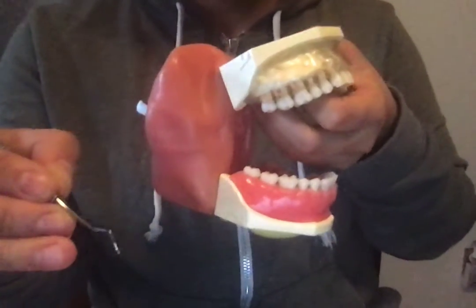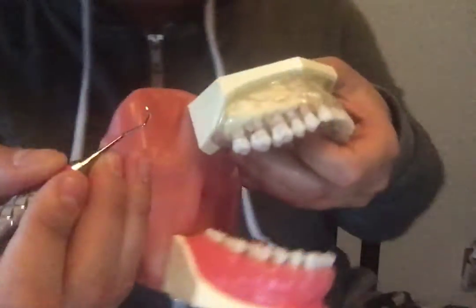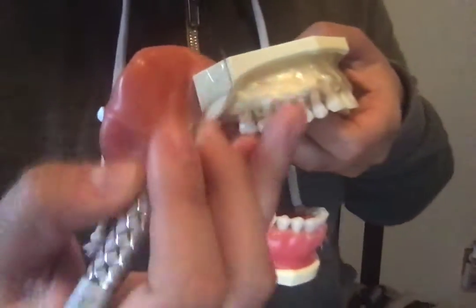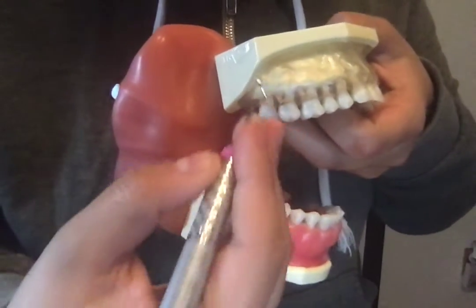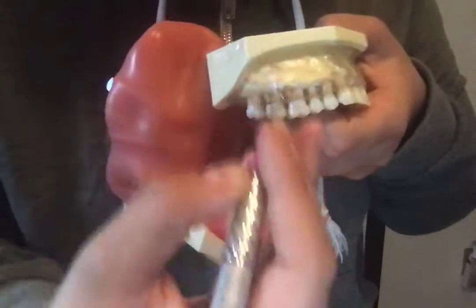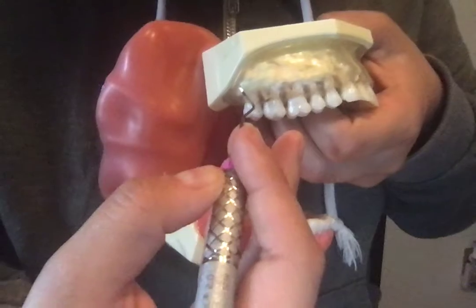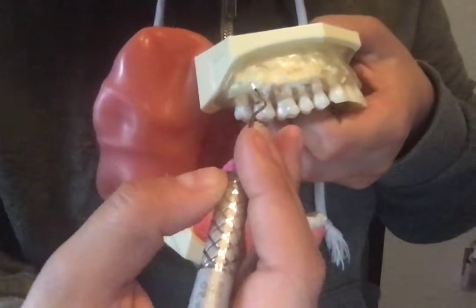When you move on to your typodont, or in a person's mouth, you are going to use your ring finger as your fulcrum. For posterior teeth, you're going to be placing your fulcrum on the occlusal. For anterior, you're going to be placing your fulcrum on incisal edges. You should always place your fulcrum one to four teeth away from the tooth you are working on.